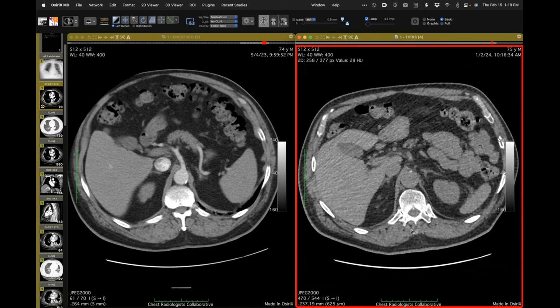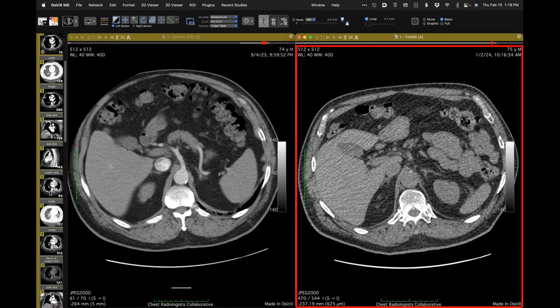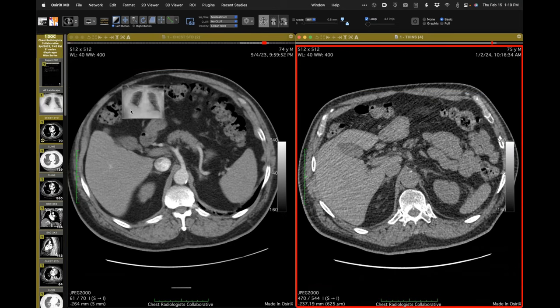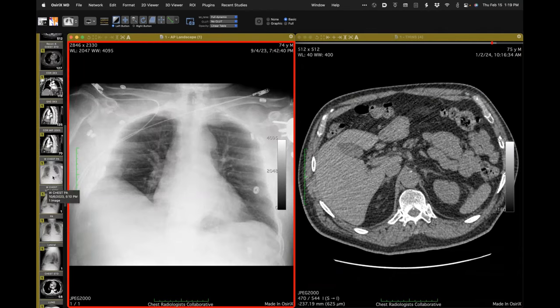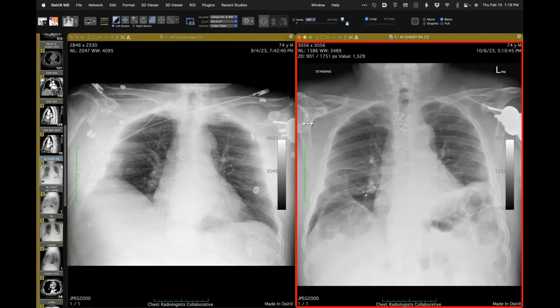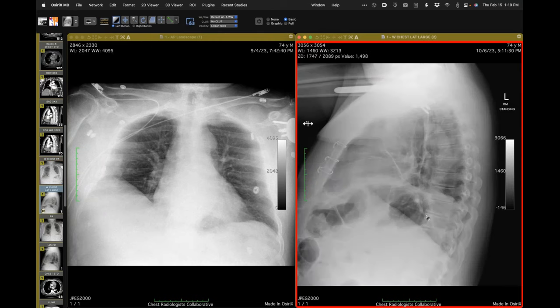Diagnosis: left phrenic nerve injury during surgery, left hemidiaphragm paralysis, explaining the atelectatic lung. Bedside radiography before surgery is normal. Post-op, the left hemidiaphragm is a bit elevated. On lateral projection, the left hemidiaphragm is also a bit up. Confident diagnosis of left phrenic nerve injury explaining the left lower lobe atelectasis.